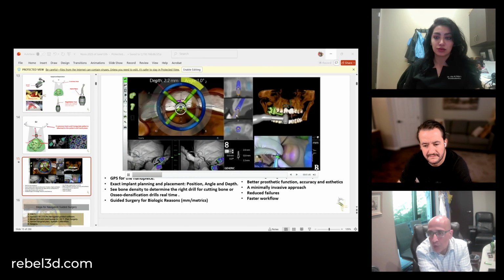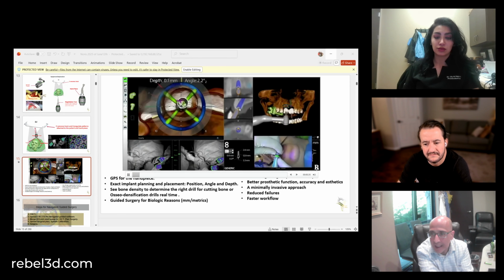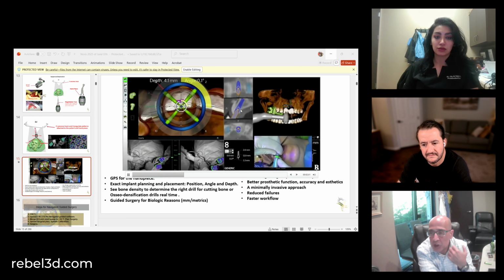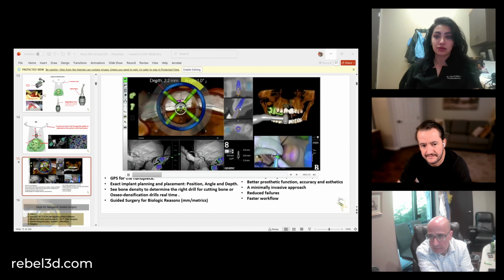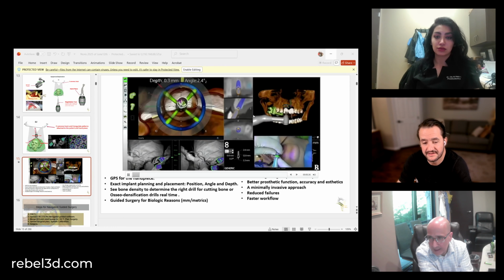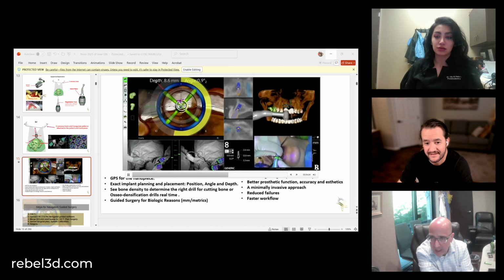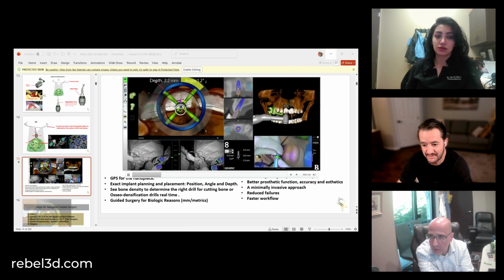So I will just go with my pilot and maybe 1 or maximum 2 osteodensification drill and go in. Now I can not just feel the bone, I see the bone density. I can determine this piece. You can do this one with the static. Make sense? Yeah, you're adjusting your drilling protocol on the fly, based on bone density as you see, to get the stability that you need.